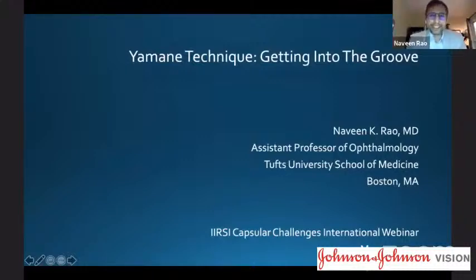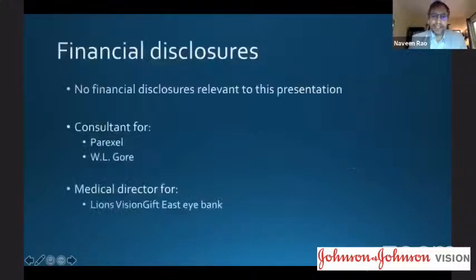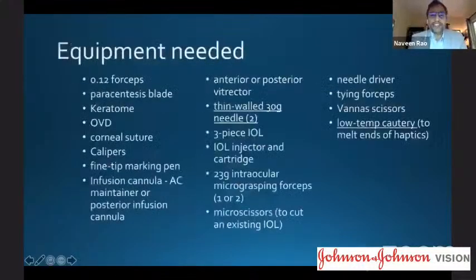So I'll be talking about the Yamane technique, which of course was developed by Shin Yamane, and I have no financial disclosures in that. There are several pieces of equipment that you'll need, but specifically the thin-walled 30-gauge needle as well as low-temp cautery are important for this technique.